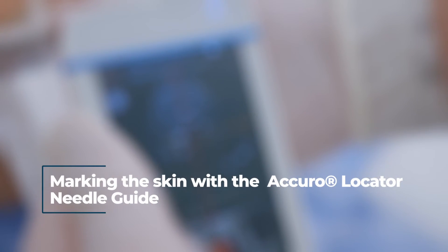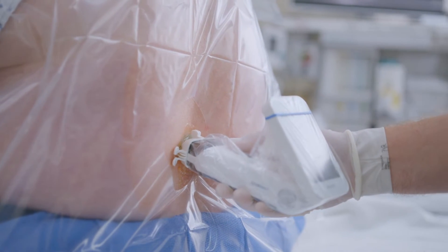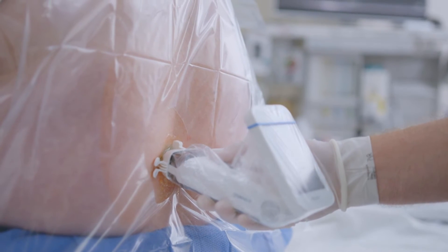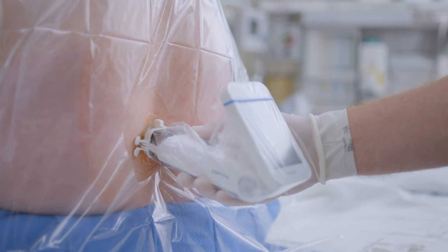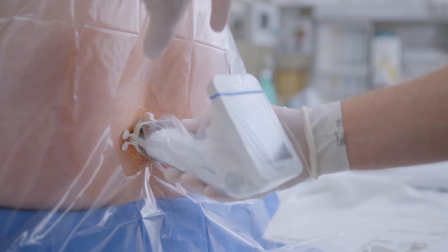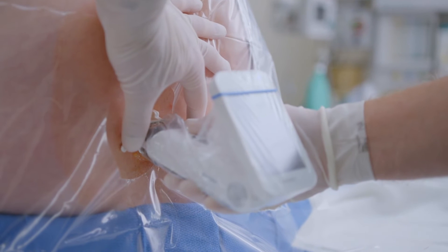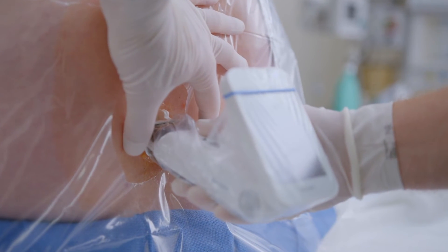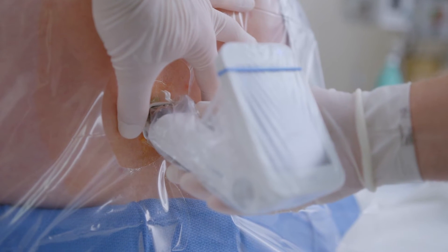When marking the skin with the Acuro locator needle guide, locate the interlaminar space and midline. Use your dominant hand to hold the Acuro firmly. With your thumb and index finger of your non-dominant hand, grab the locator inside the wings as close to the Acuro as possible. For best results, stabilize your non-dominant hand against the patient's back while holding the locator and Acuro in place.